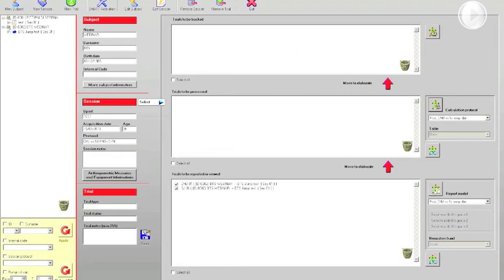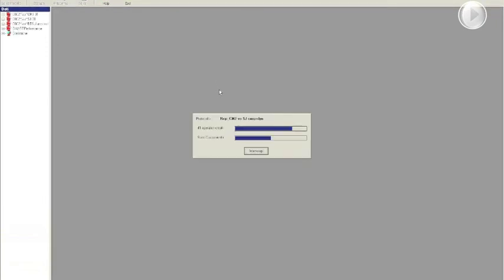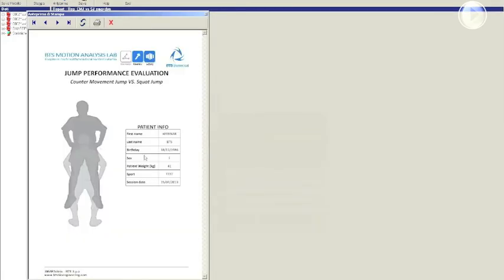And we just need to report our analysis. So this is going to be our final report. As always, we have a preview that is going to be displayed here very fast. Jump performance evaluation, counter movement jump versus squat jump. Here we have the patient info.